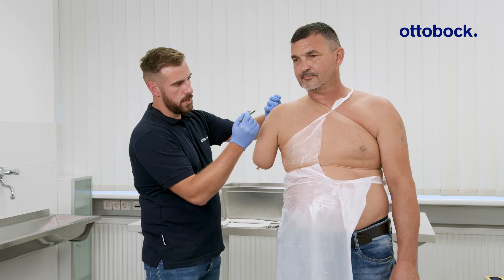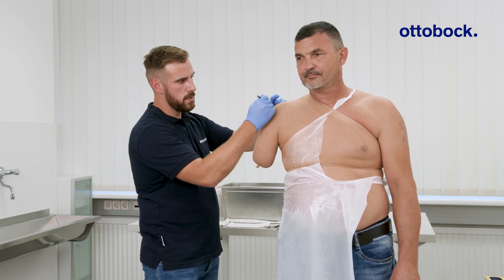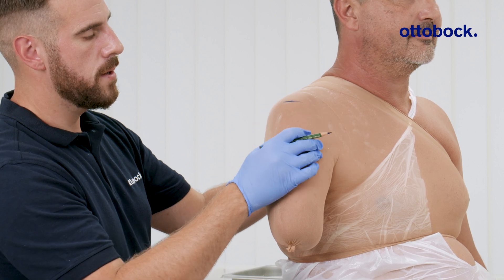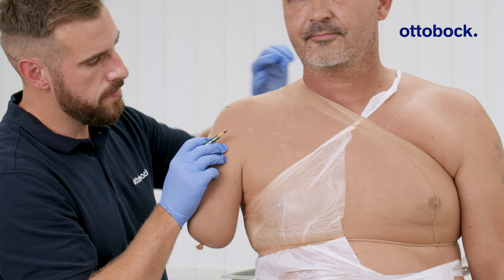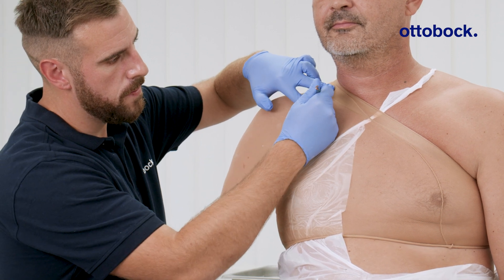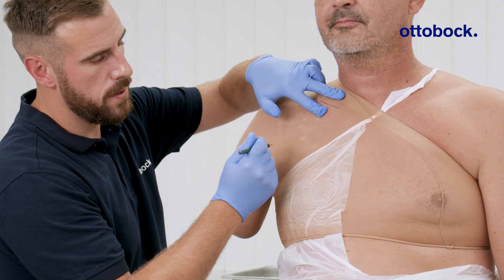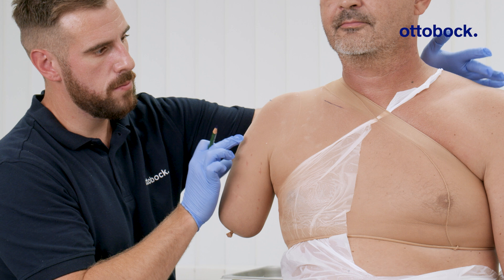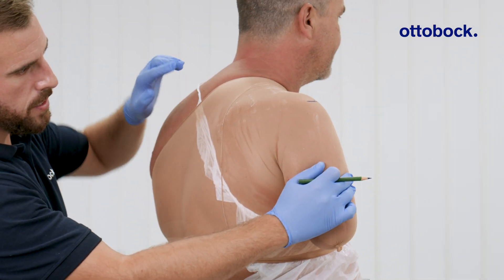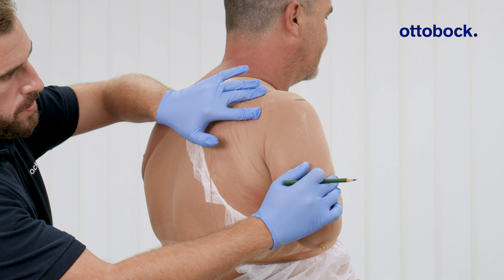Next, define the trim line. Position it just below the acromion. Use the clavicle to mark the anterior boundary and the scapular spine to mark the posterior boundary.